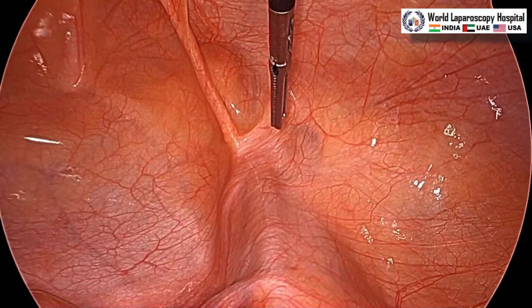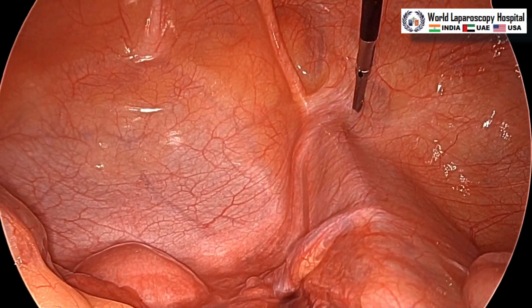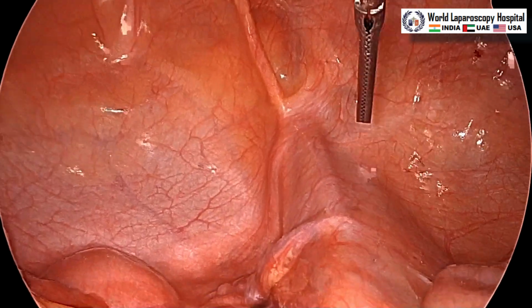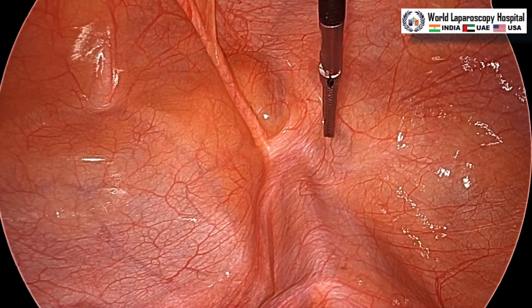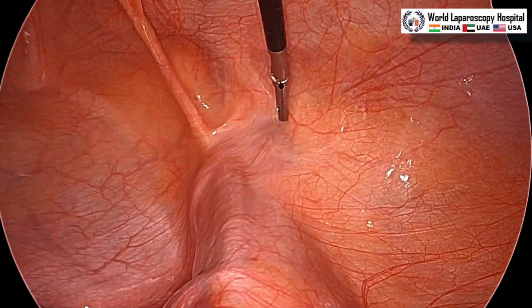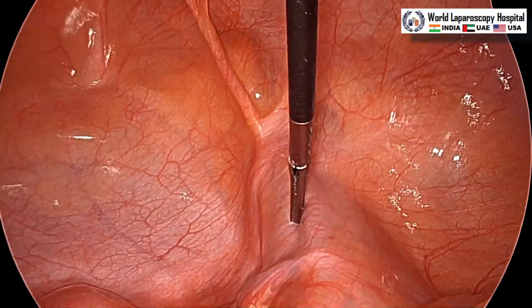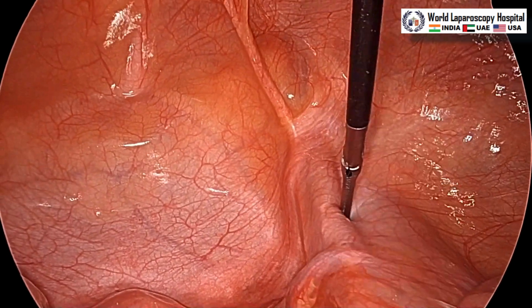This is the deep ring, this is the round ligament going, and this is the triangle of Doom. Here is the psoas muscle, and these are the external iliac artery and vein which are visible over the psoas. Here is the triangle of pain where LFCN and GFN will be. This is the deep ring, and this is the triangle of pain. The external iliac artery and external iliac vein: vein will be medial, artery will be lateral.